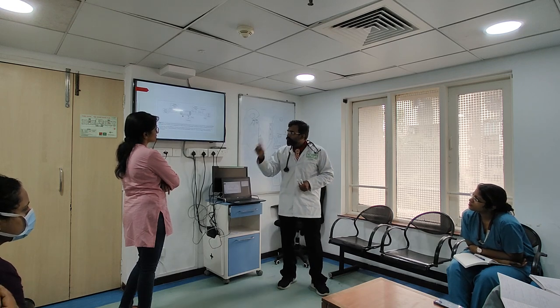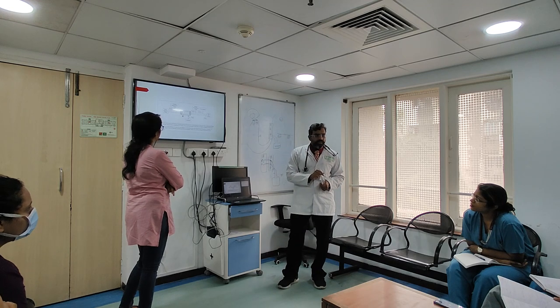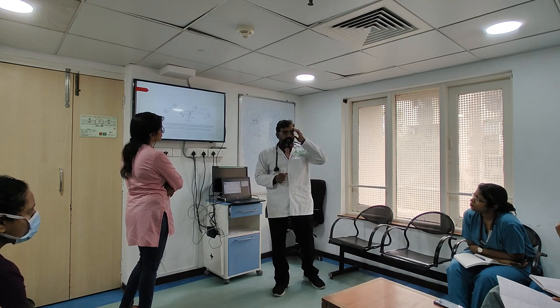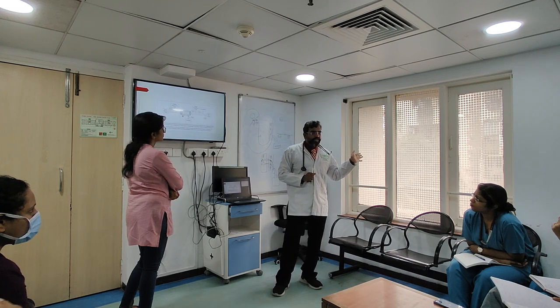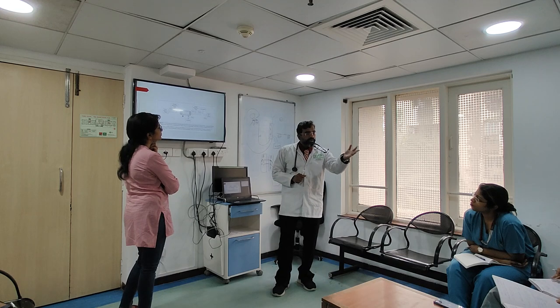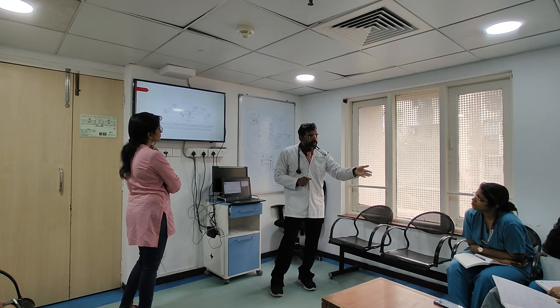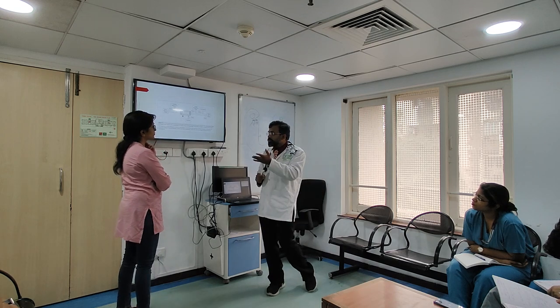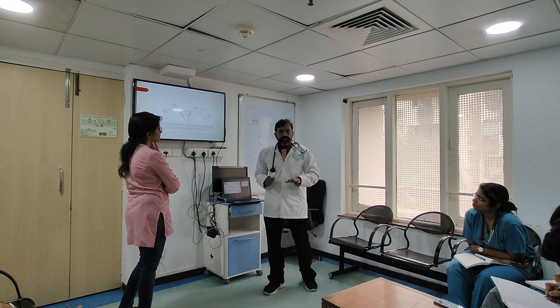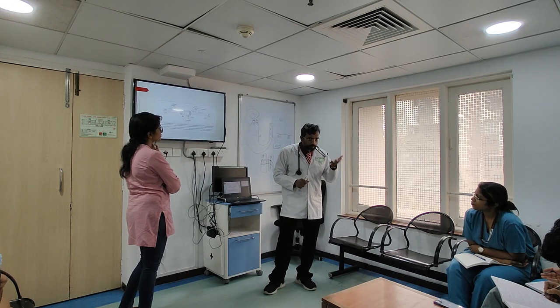So if I would increase the flow, what's going to happen? Convection. Are you understanding? Samajh mein aa raha hai? Don't consider this as replacing what I'm losing. No, it's not like that. Take it out from your mind. The therapy is improving when I improve my convection. If my convection goes higher, my therapy is better. Now the problem is where to put this fluid. That is the big problem. Where to put this fluid?